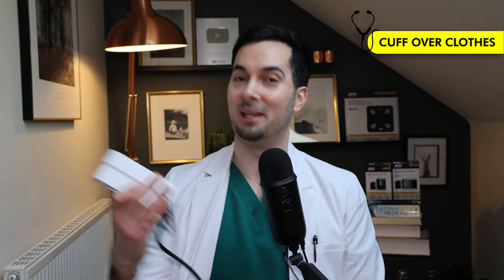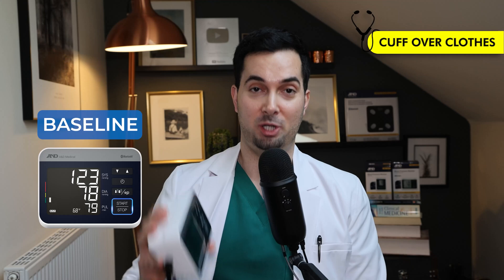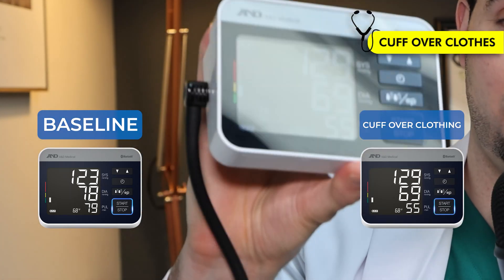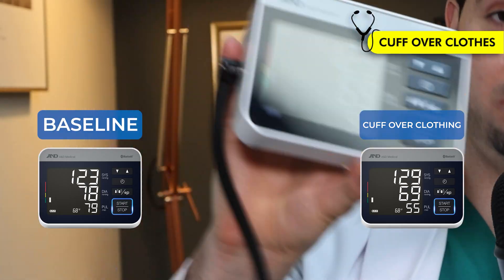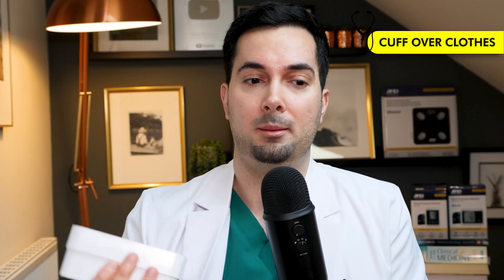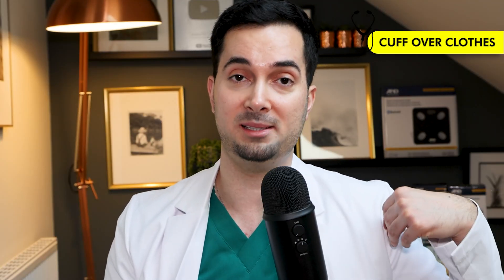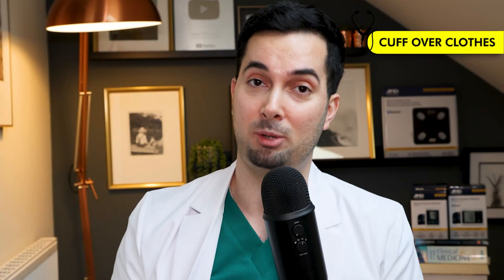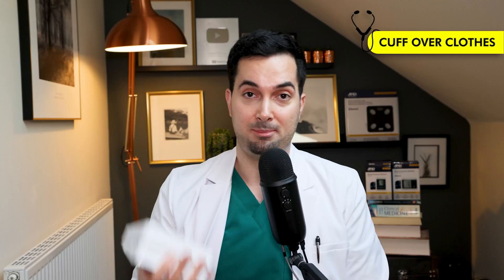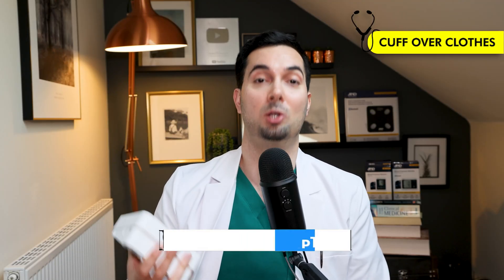Results are in. Remember, baseline was 123/78. When I took my blood pressure over this sleeve, it went up to 129 over 69. I'm surprised it wasn't higher — this is quite thin material. Bear in mind that if you're rolling your sleeves and putting a lot of pressure on your bicep, or if you've got thicker material, it's probably going to be an even higher reading. Make sure your arm is bare and watch our video on how to take blood pressure properly.